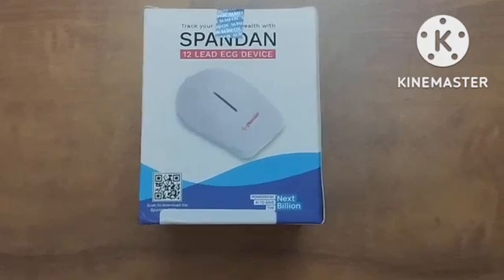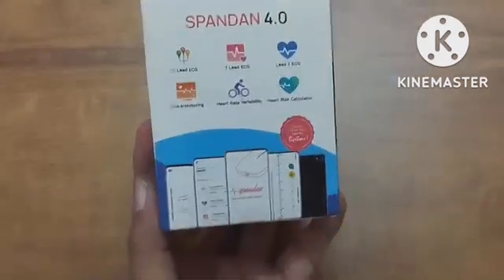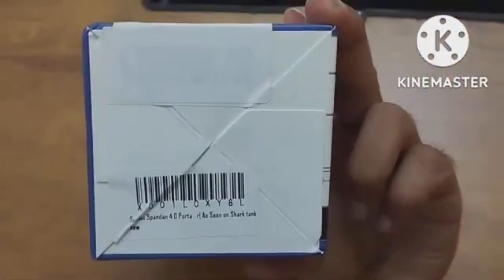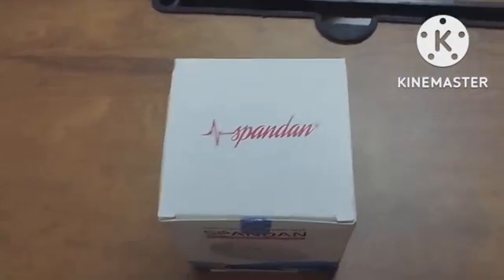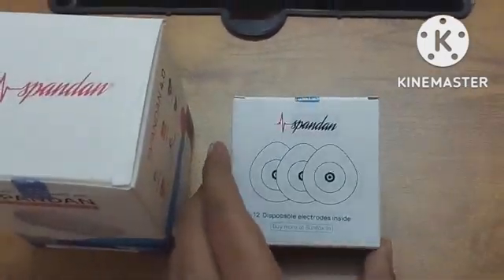Have a look at its exterior and size. It is a very small device. Along with this device we get 12 disposable electrodes inside.